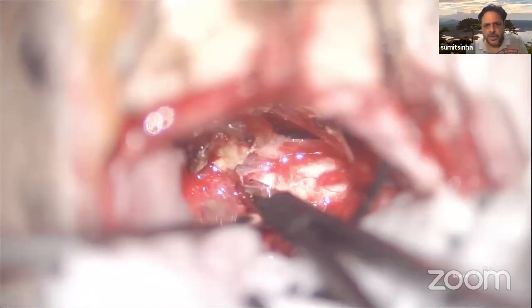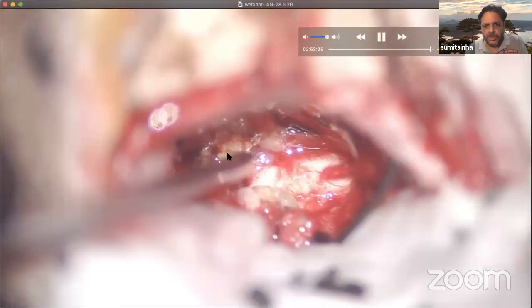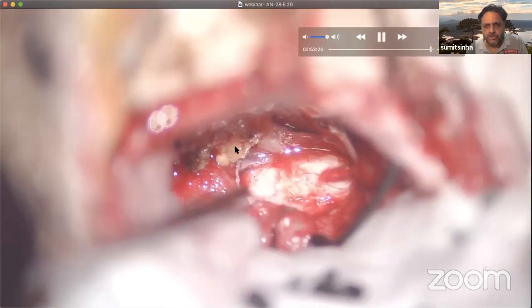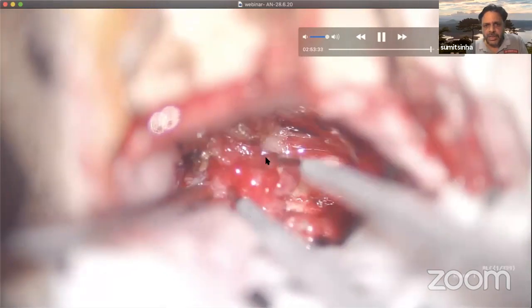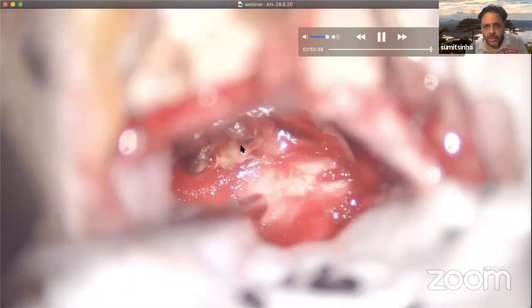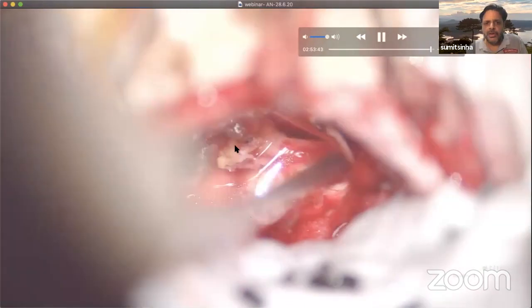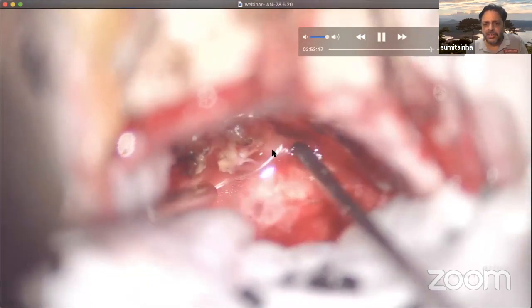Yes. So this is the final portion of the tumor, a small sub-centimeter portion which is still clinging on to the facial nerve. I will see to it that if it is easily removed, I will remove it. Otherwise, I will choose to electively leave it, because there is no harm in leaving a few millimeters of the tumor rather than damaging the intact nerve. And there you go.